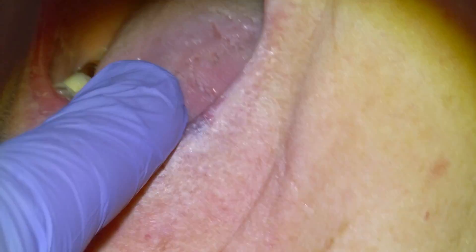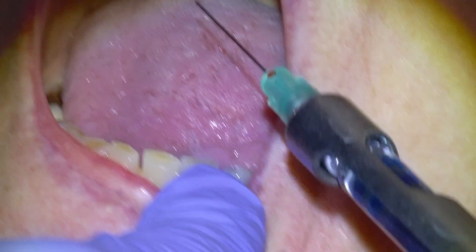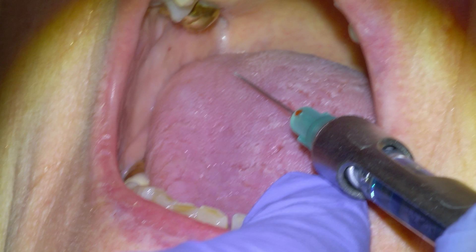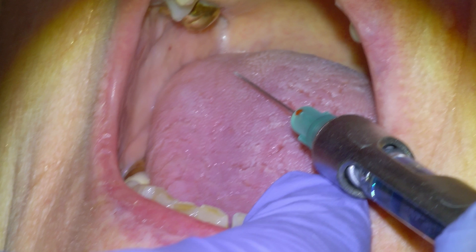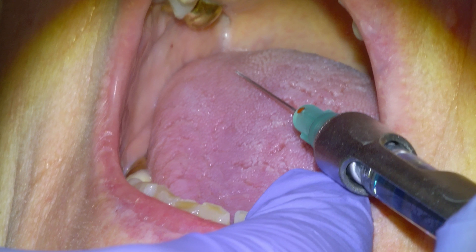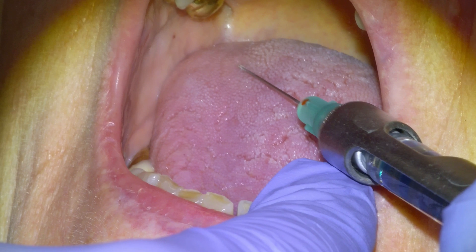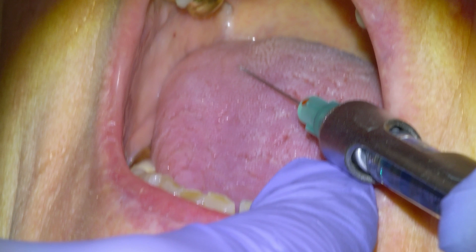So you're going to feel a sharp pinch in the back of the mouth here. We'll have them open as wide as they can. Landmarking is the same as dental school would have taught you — barrel on the premolars. I'll put a finger there to stabilize the needle.